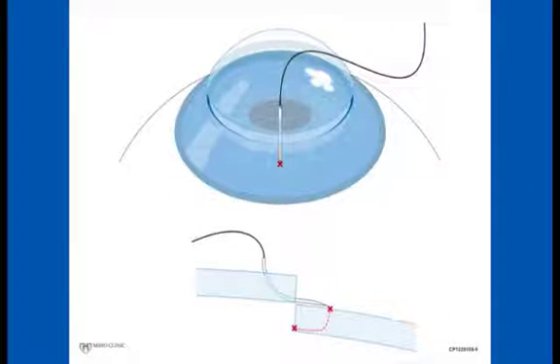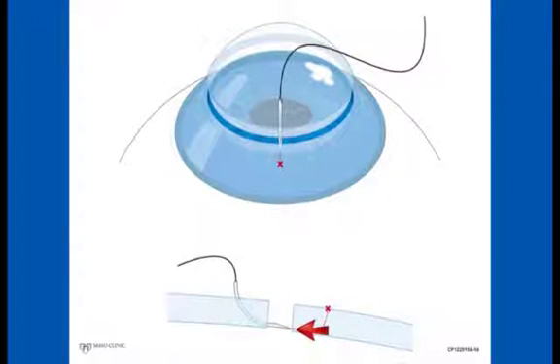The best way to ensure that the needle will end up parallel to the deep surface of the host is to start with the needle parallel to the anterior surface of the host. Also confirm that it is in the proper radial position and that 0.8 to 1.0 millimeters of needle is exiting the graft edge. It takes some time for the residents to learn how to confirm the needle is actually parallel to the anterior surface.